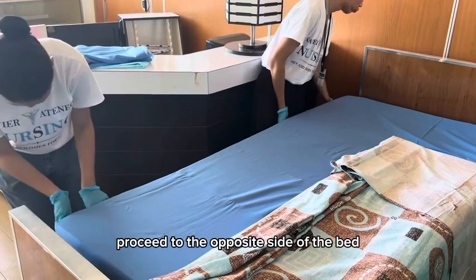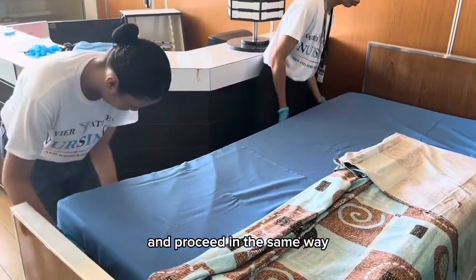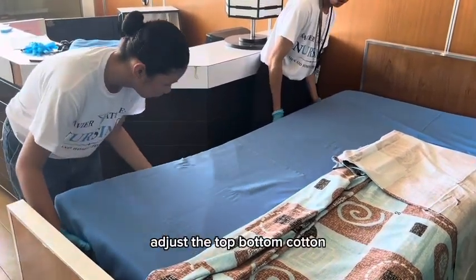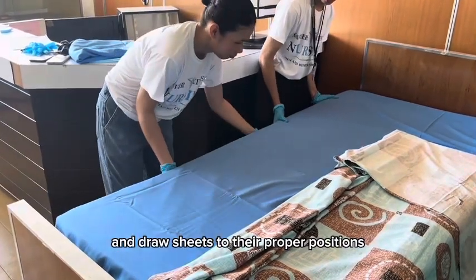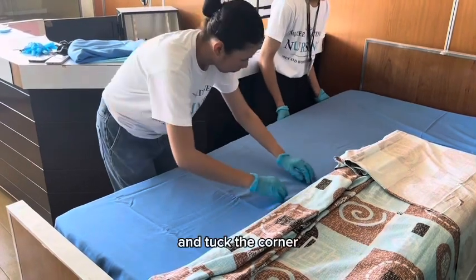Proceed to the opposite side of the bed and proceed in the same way. Adjust the top, bottom, cotton, and draw sheets to their proper positions. Miter and tuck the corner.